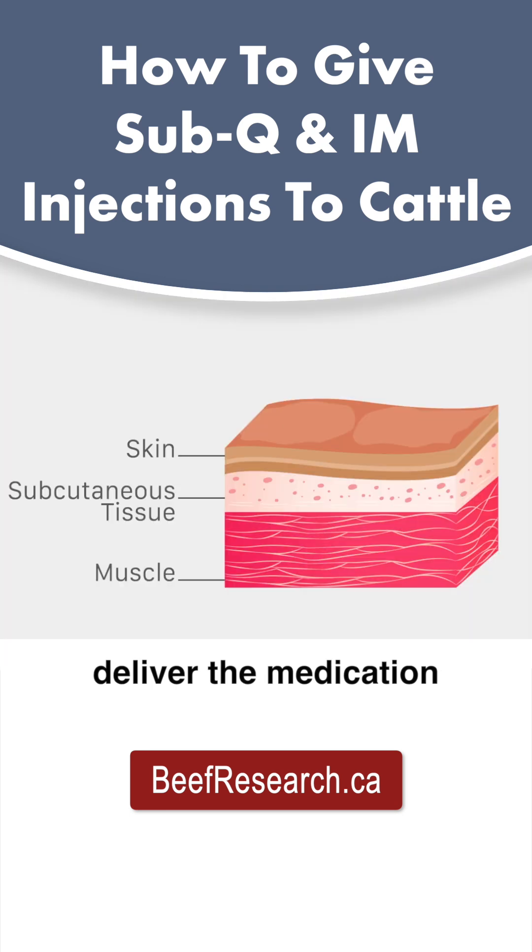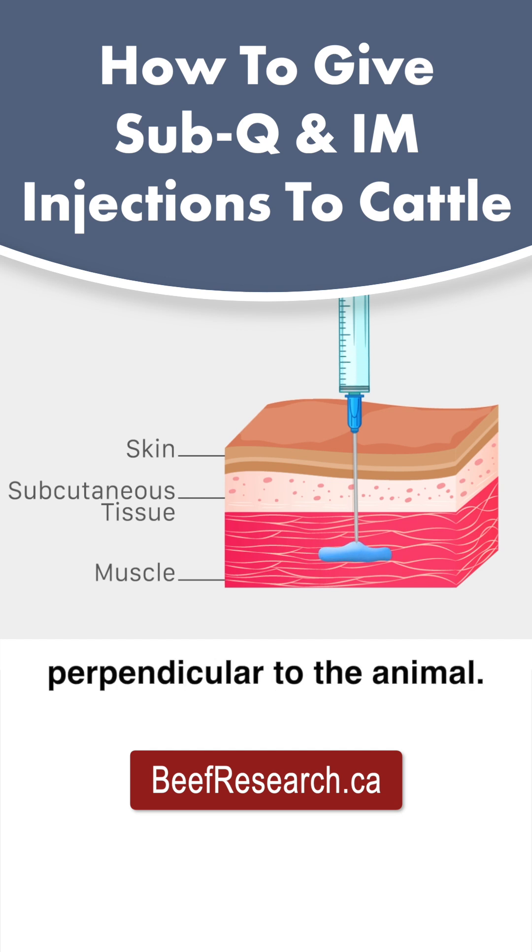Intramuscular injections deliver the medication directly into the muscle of the animal. This is best accomplished with a longer needle that is placed at a 90 degree angle, or perpendicular to the animal.